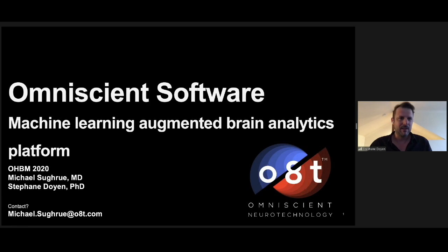Welcome to this class. I'm Stephane Doyen, and online we have Michael Sughrue, and today we're going to present you our software. We come from a company called Omniscient, and we're presenting a software that allows you to do brain analytics, leveraging some of the latest work on machine learning.